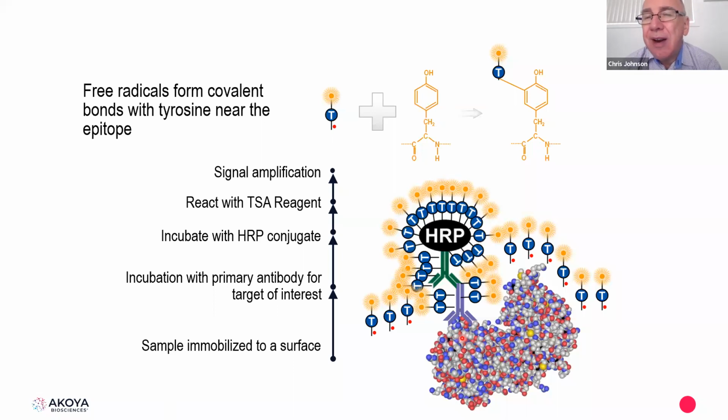So you need to have an understanding, and again, there are references for this, of how the epitope reacts to multiple cycles of antigen retrieval. Also related to that is where the best strength of the dye is going to be. So it is all a little bit of trial and error.